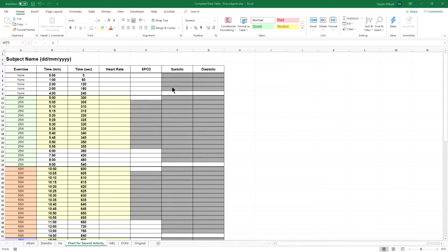First thing we'll be doing is recording heart rate. We did collect heart rate last time, but this time we are going to be recording heart rate in a much more frequent manner, as you can see in the template here. We'll be recording heart rate every 60 seconds in the resting period. And then in the first minute, as we transition from each phase, we'll be collecting heart rate every 5 seconds.